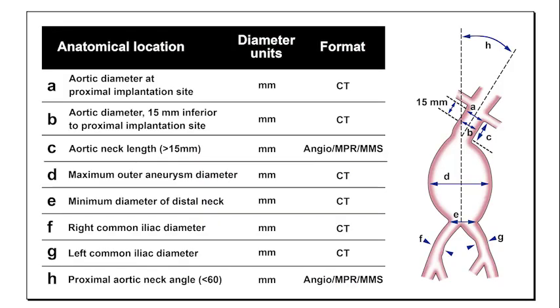Once the decision is made to pursue EVAR, preoperative sizing must be performed in order to select the most appropriate endograft. Precise sizing is the key to avoiding graft failure after EVAR. To maximise the chances of obtaining an adequate seal between the graft and the aorta wall, endografts are typically oversized by 20% of the normal aorta diameter. Care must be taken to avoid oversizing too much. Oversizing beyond 20% increases the risk of device migration and the late complications of aortic neck dilation and aneurysm expansion.